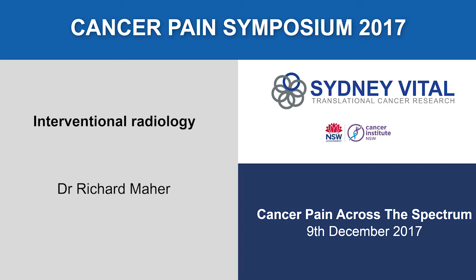Vertebroplasty we'll spend most of the time talking about. There's also kyphoplasty, which is a variation of vertebroplasty, and cementoplasty, which is injecting cement not in the spine, so a very similar technique. So what is it? It's an injection of a very fast-setting cement called PMMA via a pedicular approach, so a transpedicular approach, either one or two pedicles. And it's for painful pathological or osteoporotic vertebral body fractures.